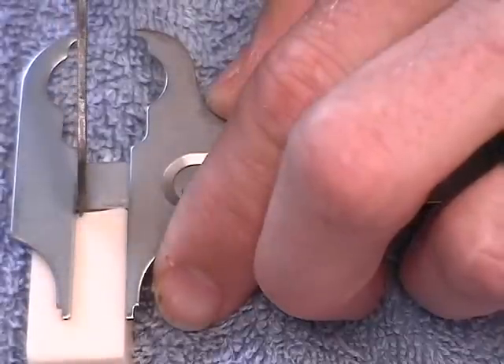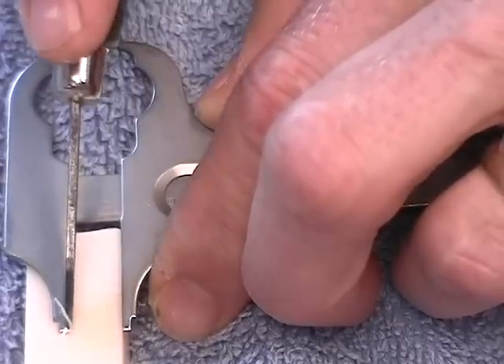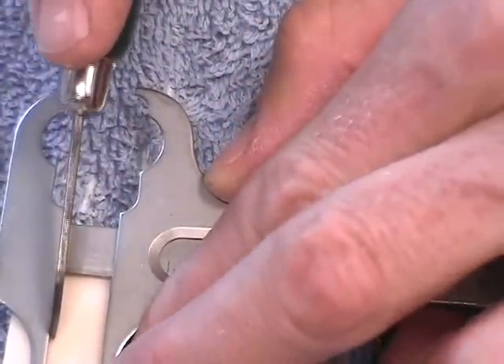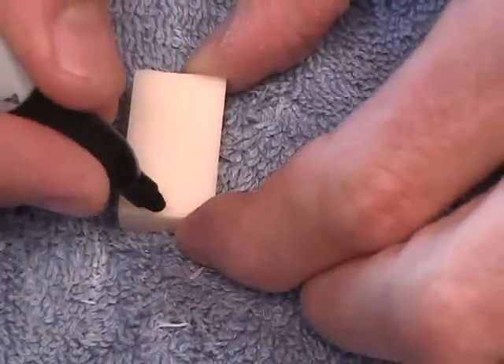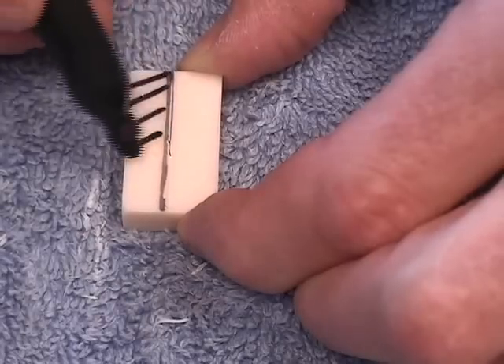We're going to score the block. Here's the line we'll be cutting out, and this is the wax that will be removed.